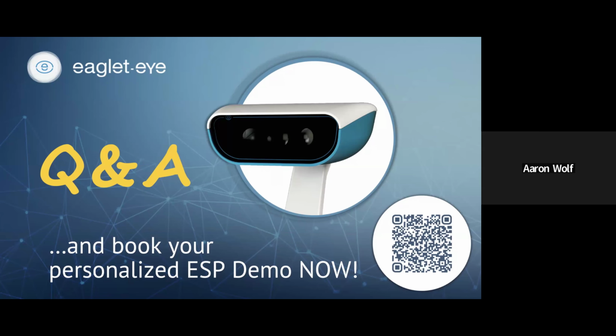And then also, some labs are compatible with certain things like HOA optics. There are other labs that may be more limited in certain diameters. I've made decisions based on what colors are available in the lenses. Some labs will carry more variety in their lens blank stock. So there's a lot of reasons that you would use different labs. The eaglet, because it's an open source platform, you could use one lab and do everything with that one, or you could use a dozen, and it gives you the freedom to go either direction.